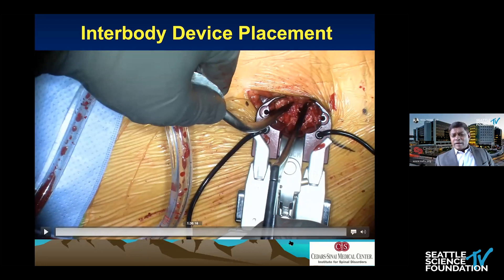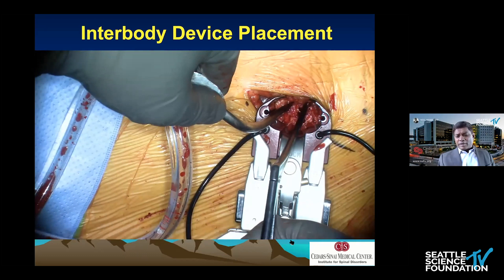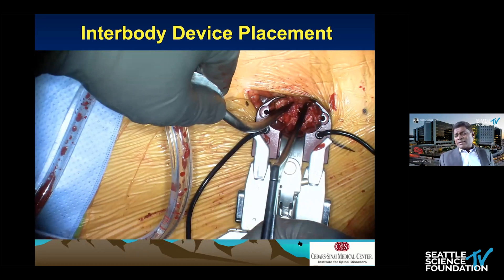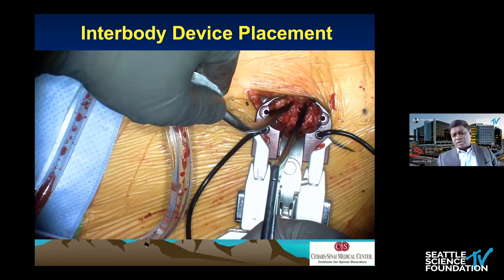Prepare the disc as well as the trials. Once the trials start going and you dilate it, the other key thing I've always said: increase height before you get lordosis. I think it's a terrible mistake to get lordosis before height — otherwise you'll kink it over and actually create posterior stenosis. If you want indirect reduction, create height first; that gives you indirect reduction.